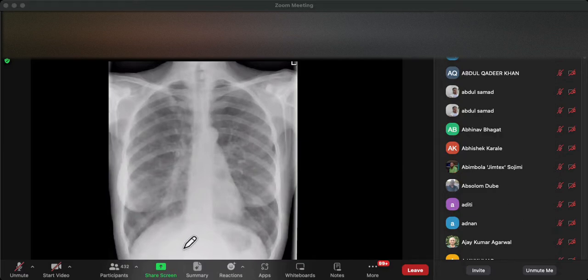Okay, now this is a great, great film. This is a really, really good film. So have a look at this. This patient has got cystic lung disease. They've also smoked. Okay, so there's a combination of emphysema. But if I tell you that as well as the emphysema, there is cystic lung disease there, what is the diagnosis?